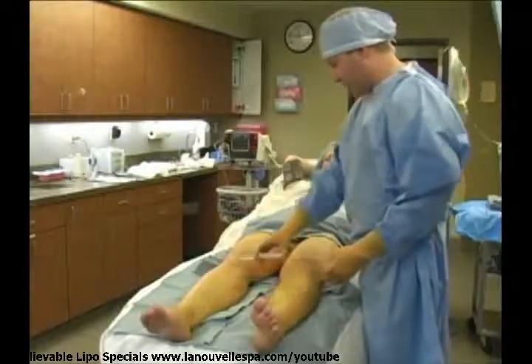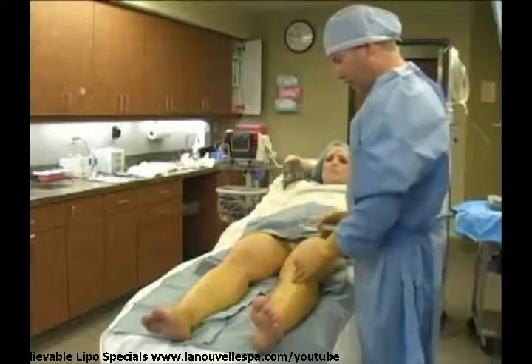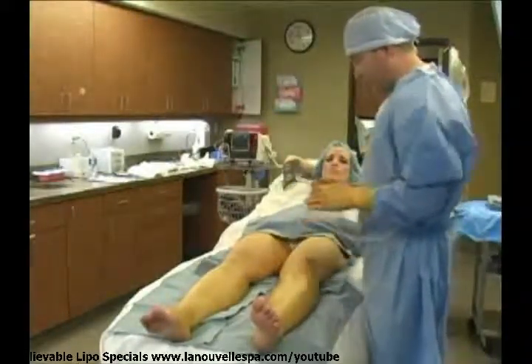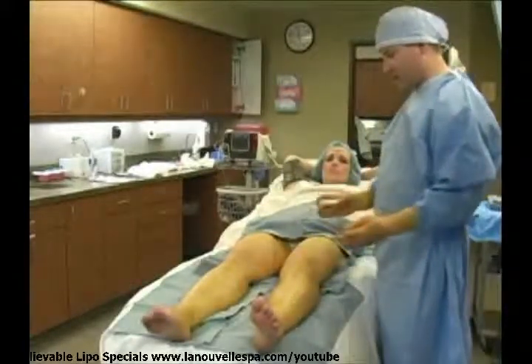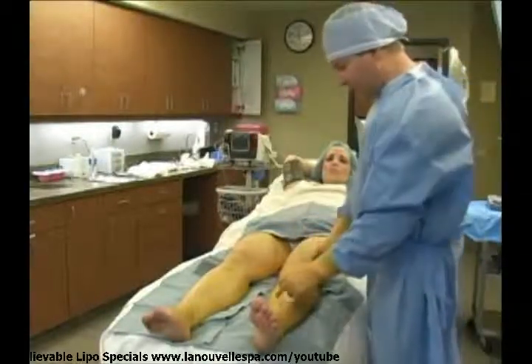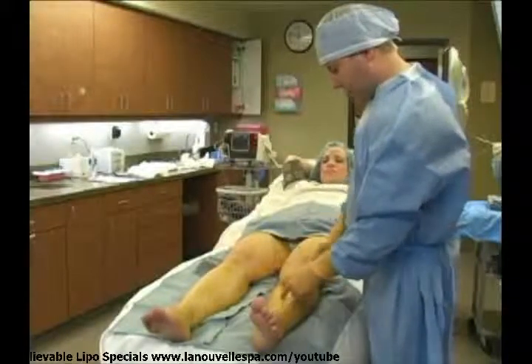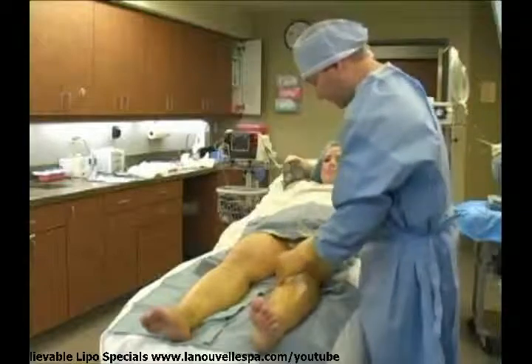I think you'd mentioned you had your ankles done one other time, and it just wasn't very thorough. That can certainly happen with any liposuction, but you give yourself a much better chance for success when you have an awake patient that you can really see the proper anatomy, that I can stand you up and see you in proper anatomic position. So this is just a little lidocaine.